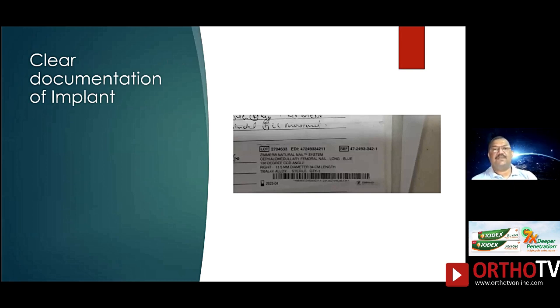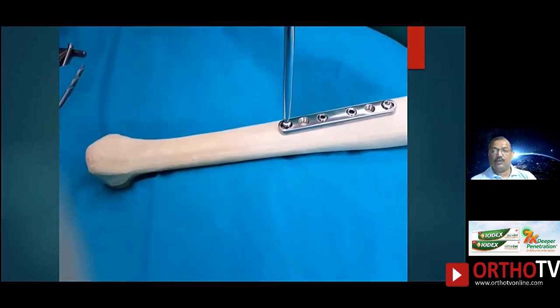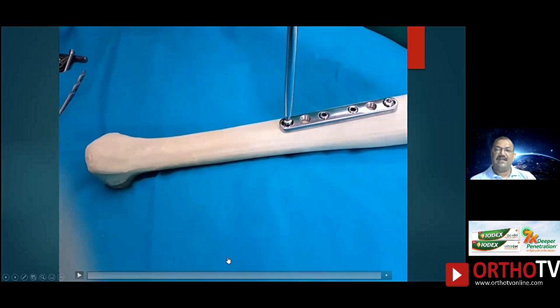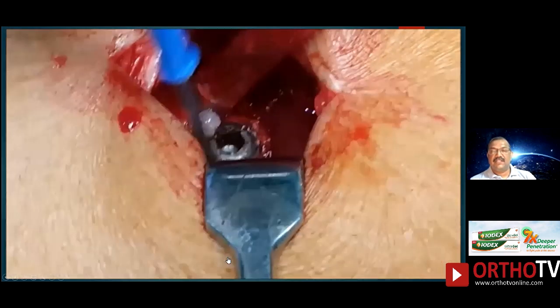Nowadays lots of implants have different types of screw heads — not all screw heads are hexagonal. There is a star drive which has come up very recently, and certain implant companies specifically have these star drives for all their implants. So it is very necessary while putting the implant to clearly mention which company's implant you put in, and especially if the screw head is a star drive you have to take special precautions to mention that. This video shows how not to use your screwdriver — if it is kept at an angle to the screw head and then rotated, the screw head will turn round.